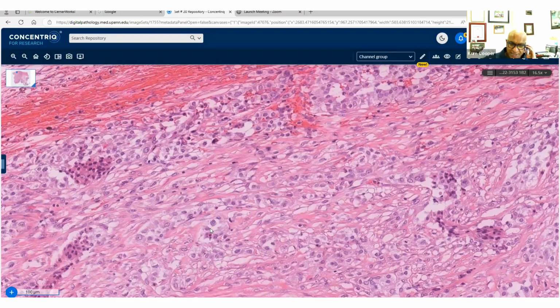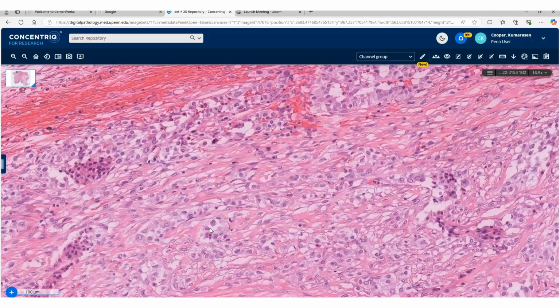The GNET consideration is an excellent one. And I mentioned in my second immunoprofile that I also like to resort to melanocytic markers, with S100 and SOX10 being positive. So this in fact is diffusely positive for S100 and SOX10. And that does bring in another differential in respect to this. Any thoughts on that? What other differential would you bring in besides GNET with a diffuse S100 and SOX10? Yeah, clear cell sarcoma. Yes, clear cell sarcoma. The GNET is the bowel counterpart for clear cell sarcoma, correct?